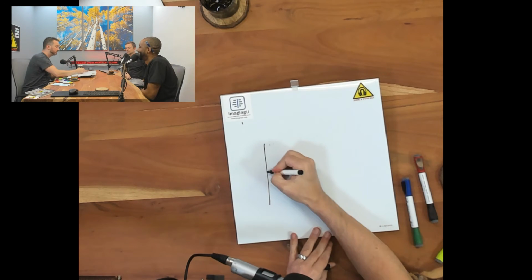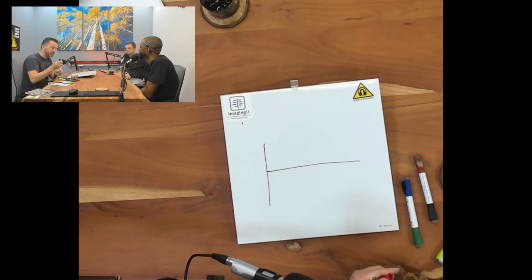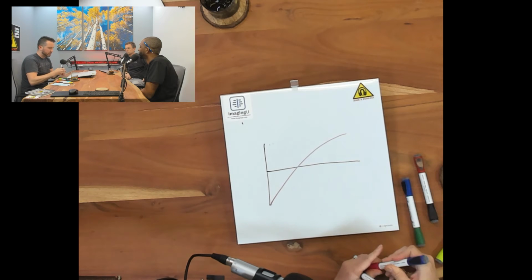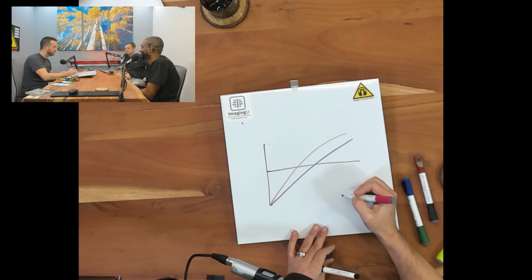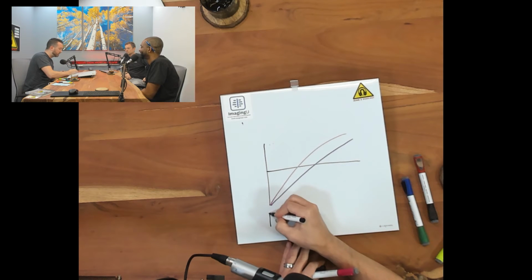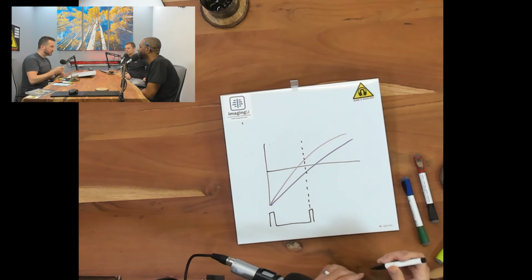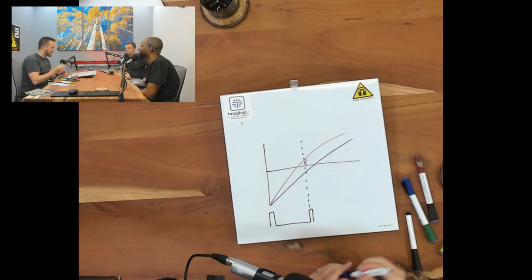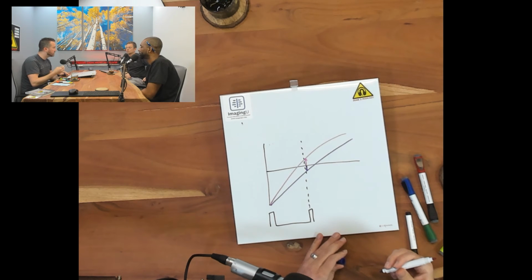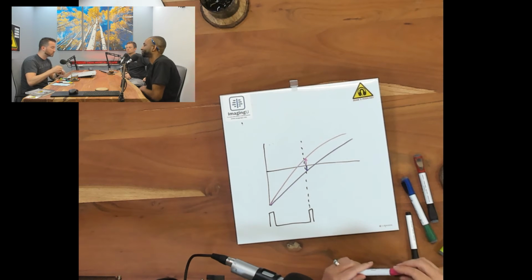So the problem with STIR, if we have this same thing going on, let's say we have just two different tissue types, X and Y. There is X. Is there double-sided markers? A game changer. And we have this one right here. If we have a bad inversion time, so if we have a 180 and right here in the center, anybody seeing the problem that's about to occur here? If you're doing magnitude reconstruction, I have just as much of that as I have of that. So if I put a 90-degree pulse into it, they will both be the same signal intensity. That's the reason why in STIRs you can change the TE, and that gives you another mechanism for altering contrast.